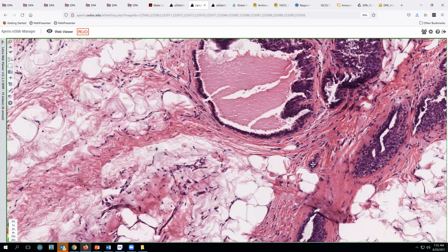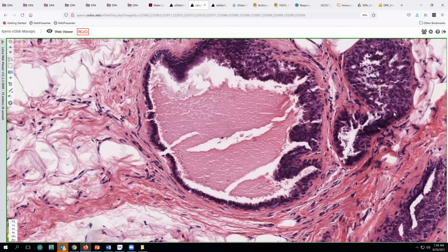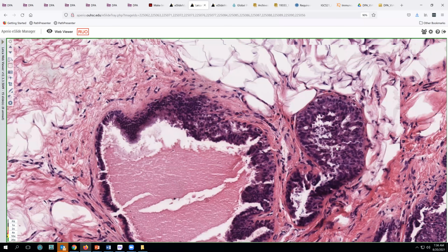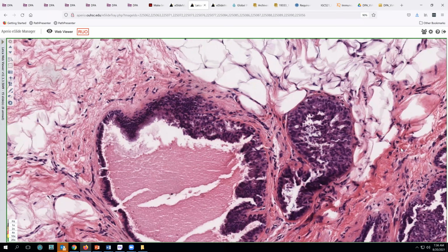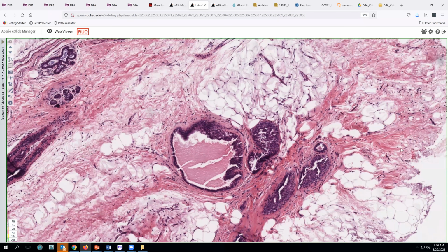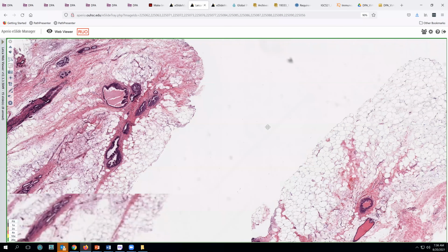Now, we do have a degree of ductal hyperplasia here. We can see the snouting on these cells, and they're sort of piled up a little bit. But this is more characteristic of usual ductal hyperplasia than of atypical hyperplasia. Atypical hyperplasia in our area looks more like ductal carcinoma in situ, but isn't either sufficiently quantitatively enough to qualify for that designation, or is not sufficiently atypical to move it to DCIS.